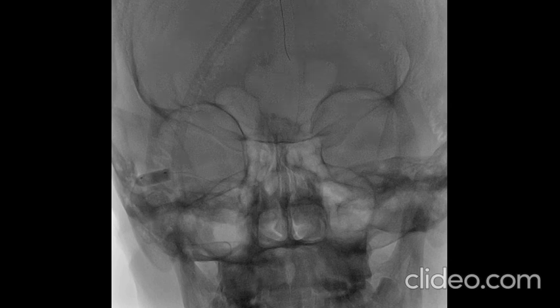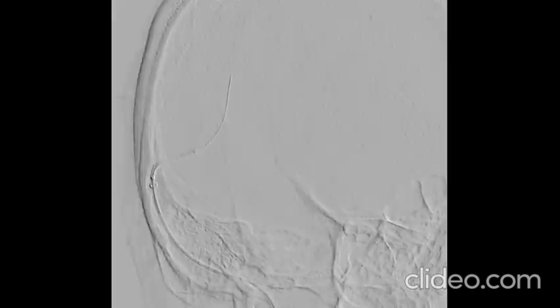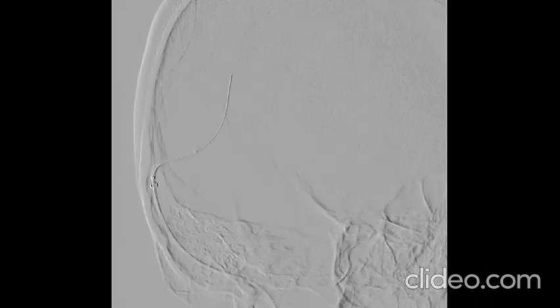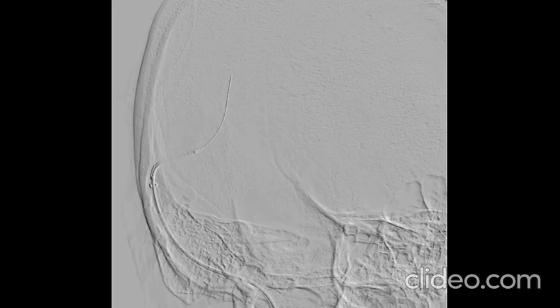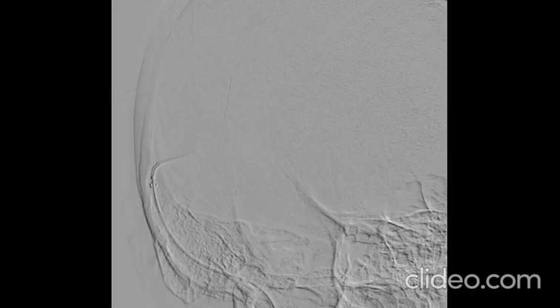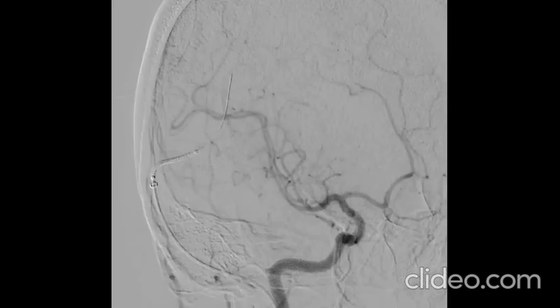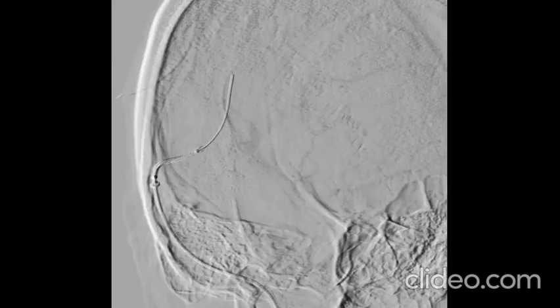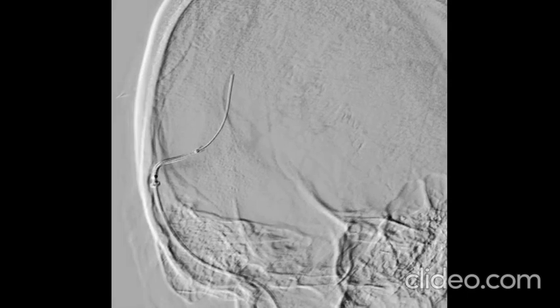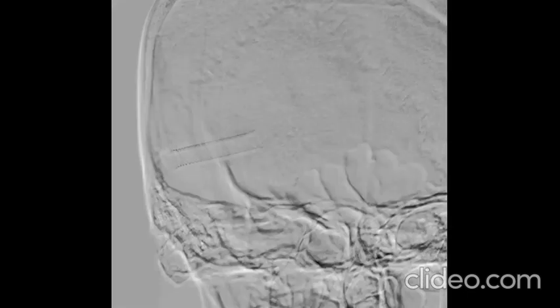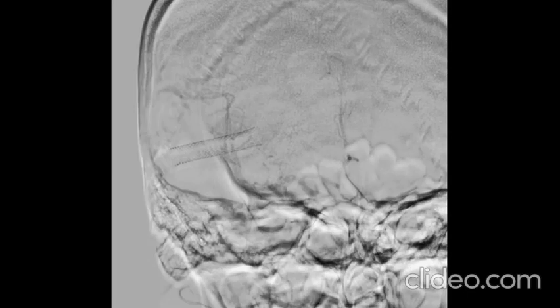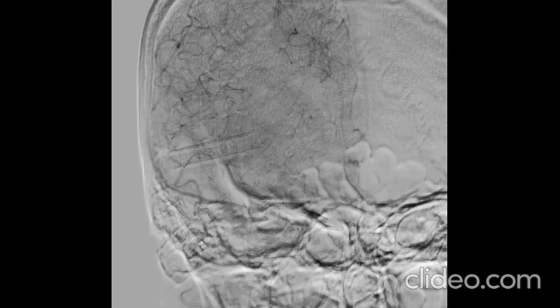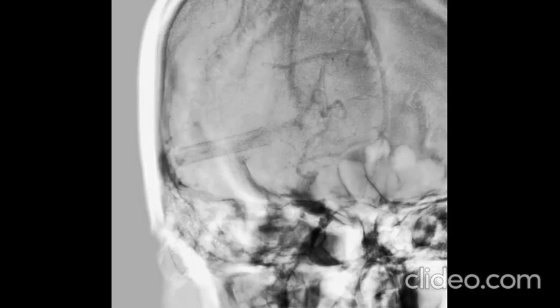Over the wire, an Abbott Xact 8×6 into 40 mm tapering self-expanding nitinol stent was deployed across the stenosis. After noting good expansion of the stent, the microcatheter was withdrawn and a check angiogram was obtained. The arterial angiogram showed good flow through the stented area without any areas of poor stent expansion or crimping.